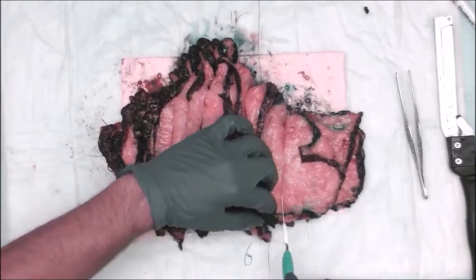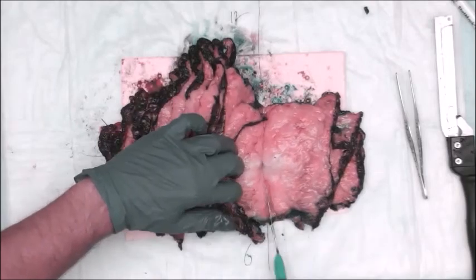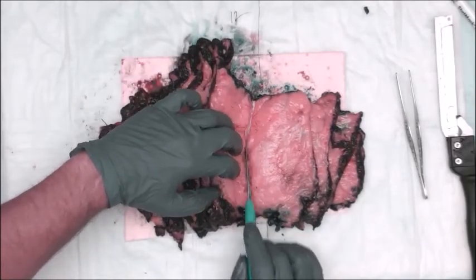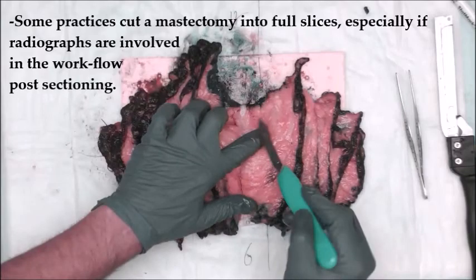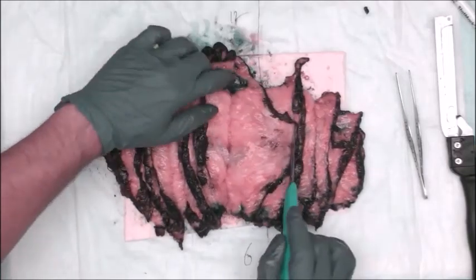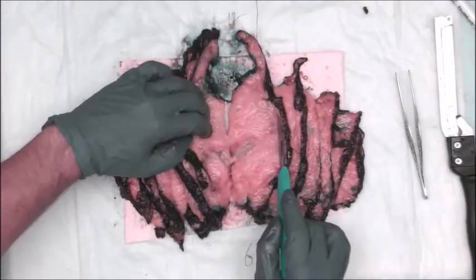So what I like to do is go back over and make sure I've got these breast margins cut all the way through. You don't have to cut all the way through the skin, obviously. Okay, but you don't want to miss anything, especially at these edges right here and here. So make sure you get nice cuts all the way through. Just like that.